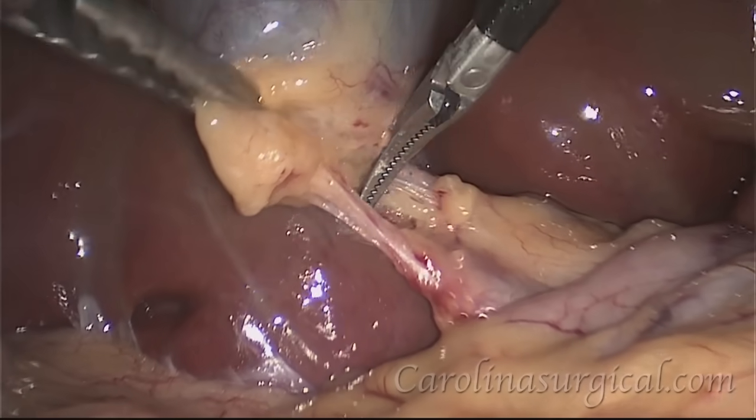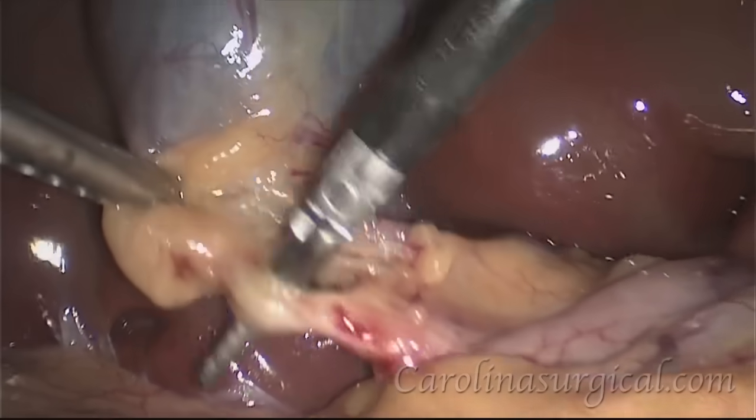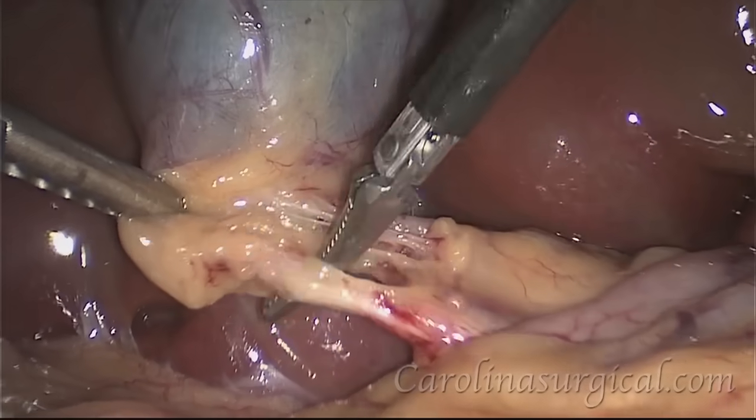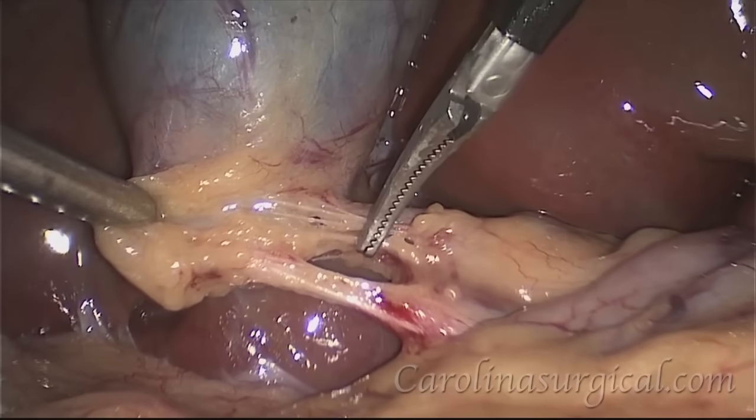This is the most important part of the procedure. We want to be very careful and make sure that we clearly identify that cystic duct going into the gallbladder so that we're not confusing it for some other structure.